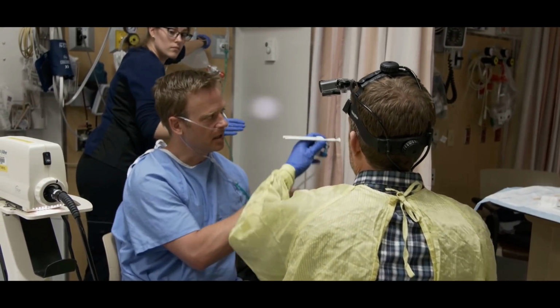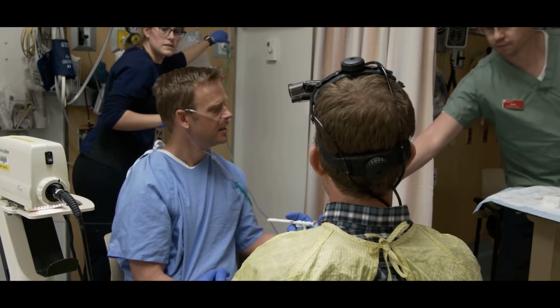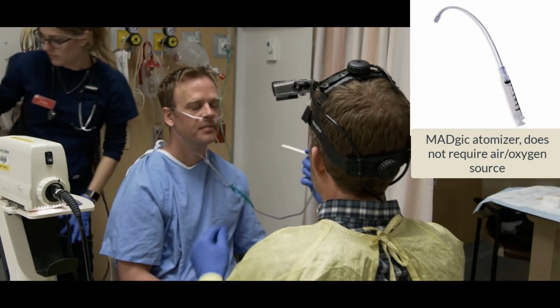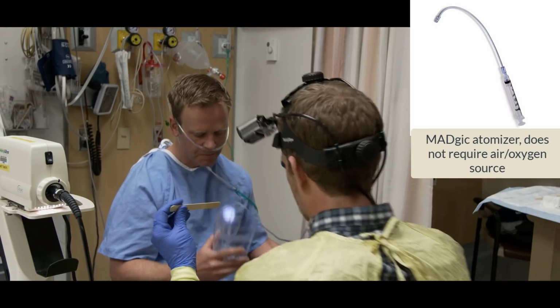Can you hand me that container there? Thanks. 8 liters. You okay? And just going to spray the uvula now, because I grabbed the uvula a couple of times.